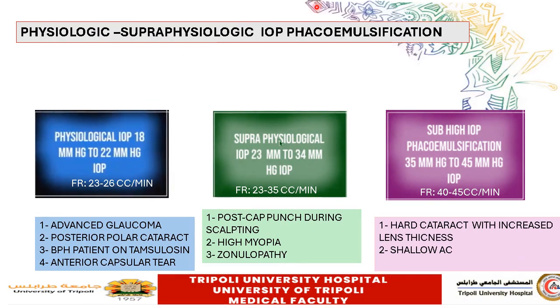Now, the innovations of active fluidics and the presence of the Active Sentry handpiece by Alcon give the doctor the possibility to adjust the intraoperative pressure and add another spectrum for the phacodynamics, so that you can set a target intraoperative pressure. Many studies have been done on setting a target intraoperative pressure, and it was found that it is useful in different indications to use different target intraoperative pressures.